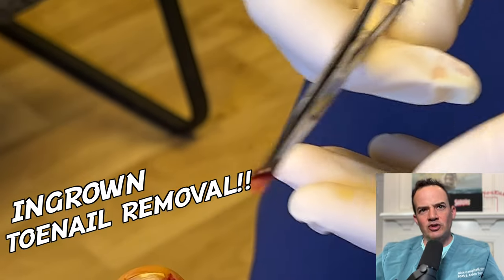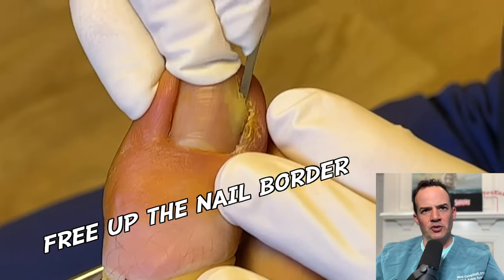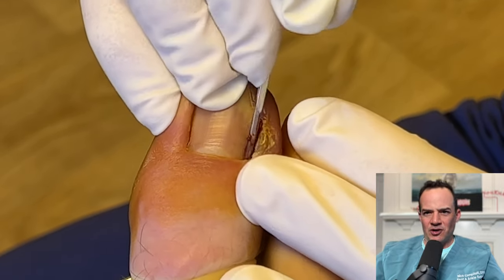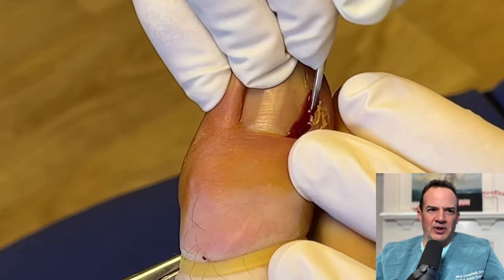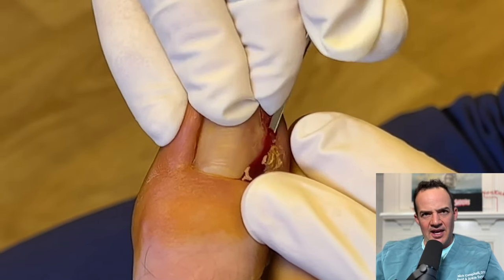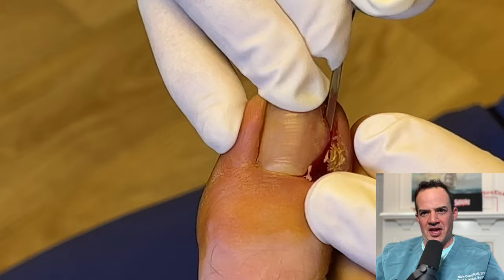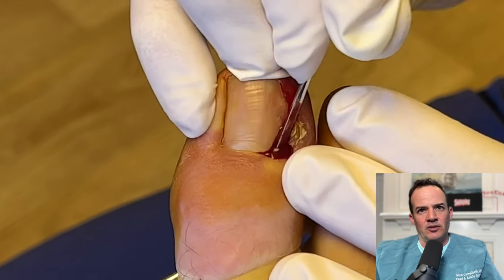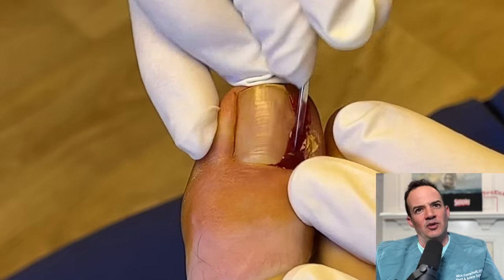This is a simple ingrown toenail removal. What you can see we're doing here is freeing up the nail border of this patient that had a chronic ingrown toenail. A lot of people get these and don't do anything about them. This particular patient waited long enough and we decided to perform what's called a matrixectomy, which prevents the toenail from coming back. So if you've ever had one of these, this is how we do it.